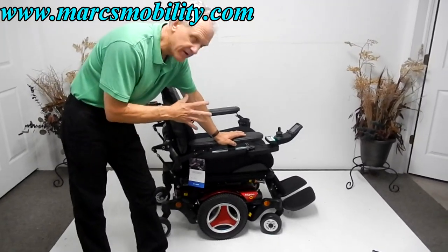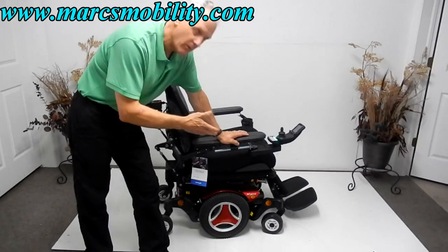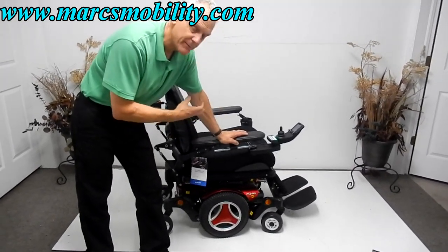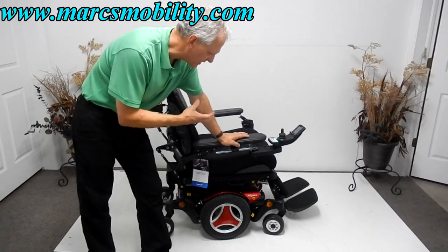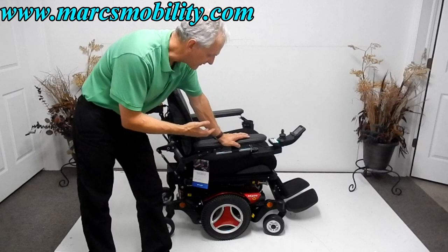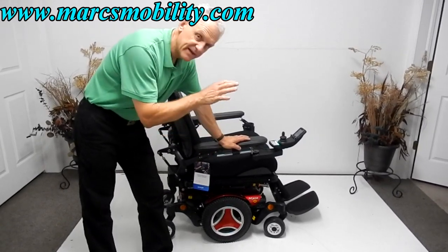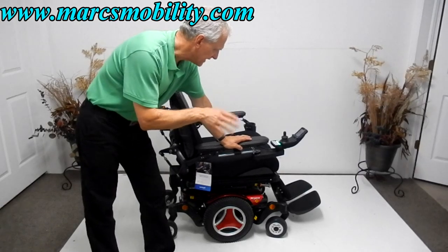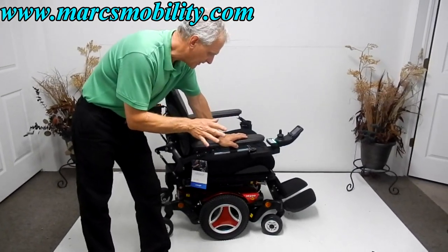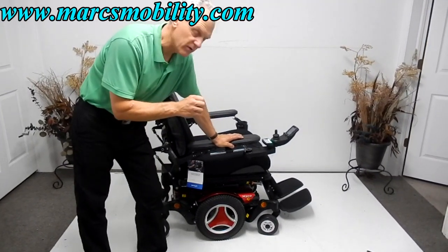Here's another beauty — if you have something practically new, you may want to look at this one. This is a Permobil M300 HD, heavy duty, with a 450-pound weight capability. It's only a few months old and has everything: the 8-inch seat lift, electric tilt, electric recline, electric legs. It has half a mile on it, so it was probably delivered and never used.